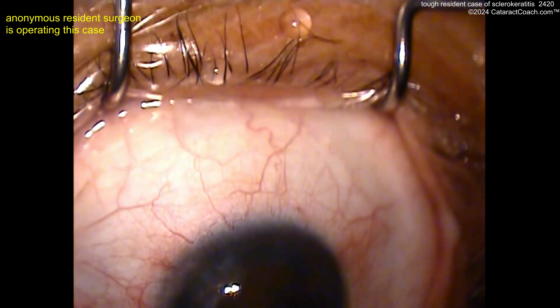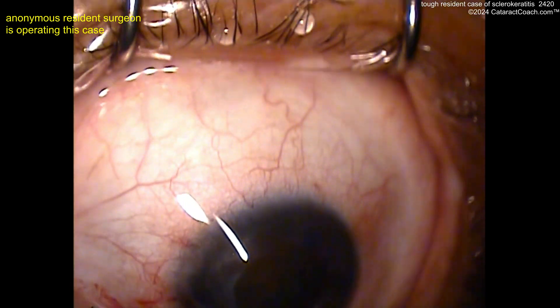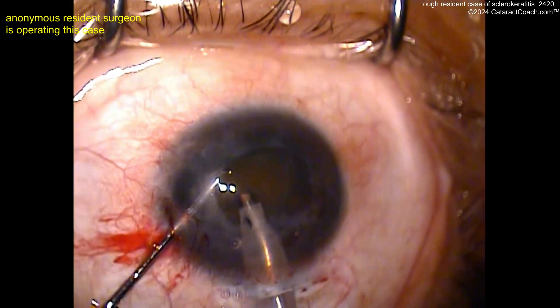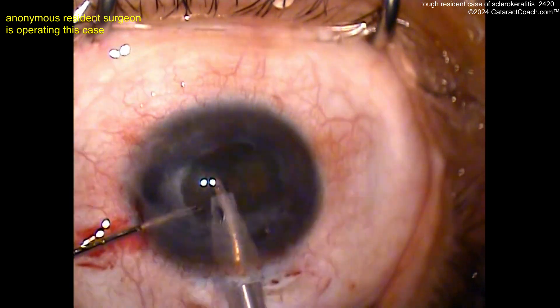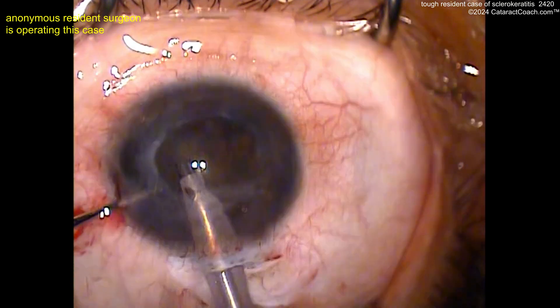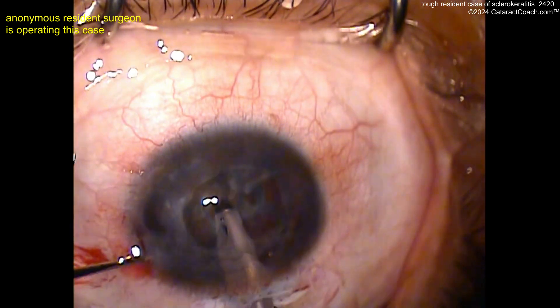A 25-part curriculum series — this is all for you, it's all free, and it'll make you a better surgeon if you have the time and desire. Now let's see the phaco technique here. I can see this patient's not so cooperative — Bell's phenomenon there. This patient needs more IV sedation or just do a subtenon's block — why suffer? Yeah, it looks like a tilt and chop — tilting it there, chopping the cataract, getting this thing wolfed down. Luckily it's not too dense. This is also a good case where an endoilluminator may make life a lot easier and give you better visualization. We saw the video of the eye chopper from Oculite — a chopper that basically had an endoscopic light source on its tip, which made visualization inside the eye pretty easy.